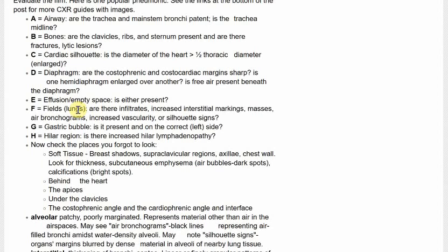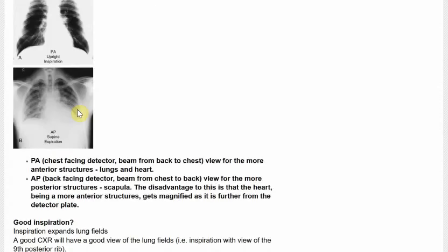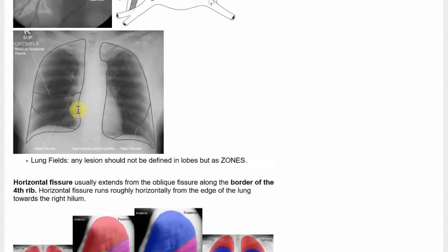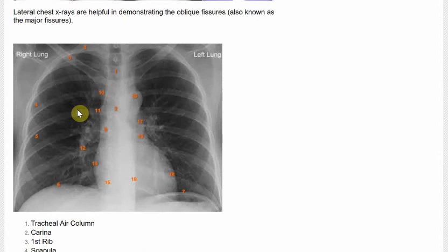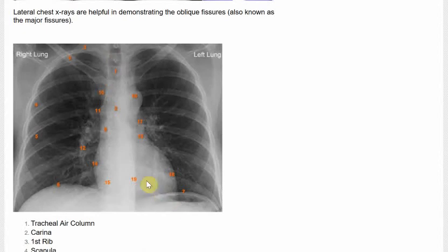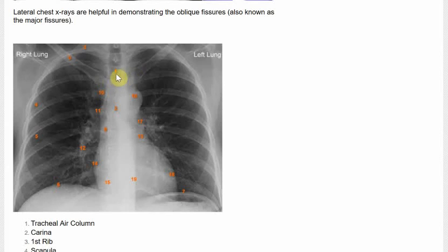My personal system, which I find quite useful rather than the checklist, is to look at the technicalities first and then go ABC right to left. So to summarize the technicality: P is for position — was it a PA or AP film? I is for inspiration — can you just about work out the ninth rib? E is for exposure — can you just about work out the vertebral column? R is for rotation — the end of the clavicle should be equidistant to the trachea. If it's a rotated film, the ends of the clavicle would not be equidistant to one another.